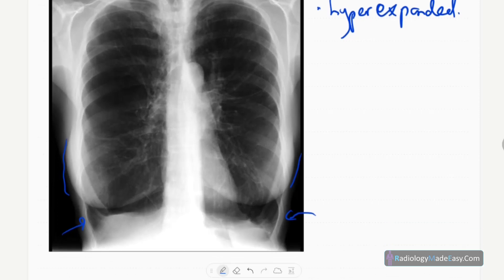The diaphragms are flattened. The mediastinum is also narrowed — a narrowed mediastinum is present. You can also see that the vascular markings are diminished throughout.